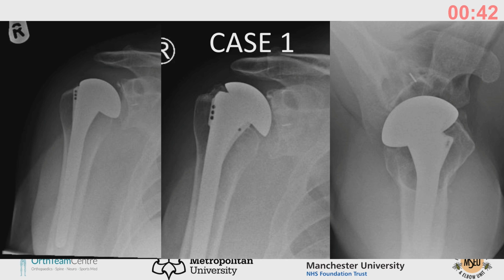So a couple of cases to finish with. This is a patient that looked like he had aseptic loosening. We're a little bit worried about some of the early stages with this wound.